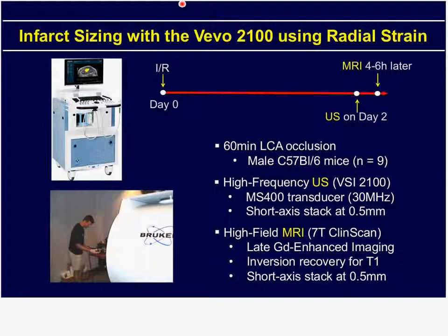The 550 can be used as well, and we've seen groups do that. So I guess there's no clear-cut answer to this based on our experience. It really does depend a lot on the model that you're looking at. And it's interesting to hear that for your particular case, the 400 is working well. So that's good information.